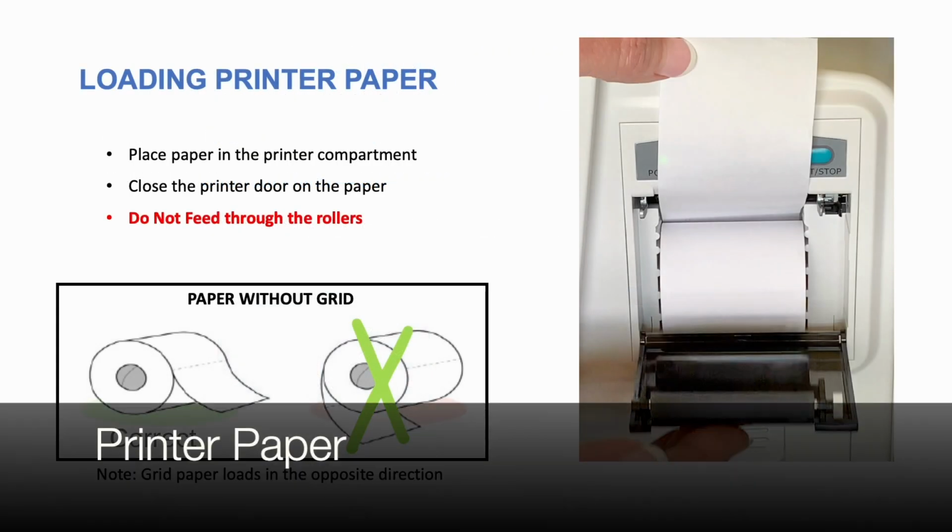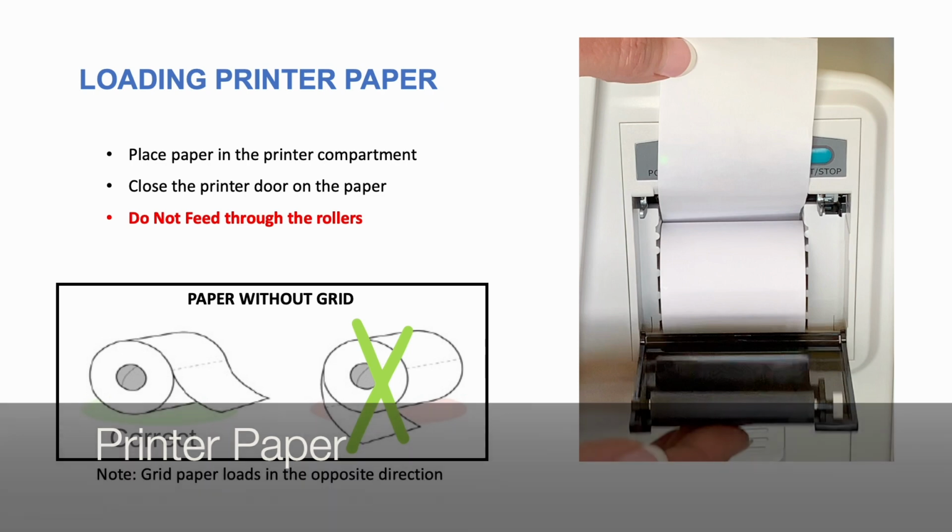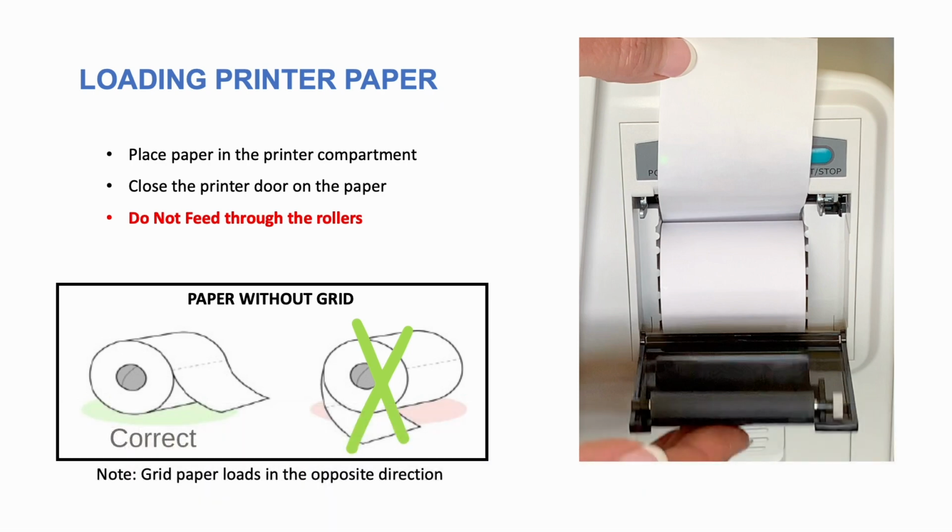Loading printer paper. The printer is a thermal printer, so it does not require ink. It does require thermal paper of a specific size that is not readily available at an office supply store. To load the printer paper, place the paper in the printer compartment and close the printer door on the paper. It is not necessary to feed the paper through the rollers.